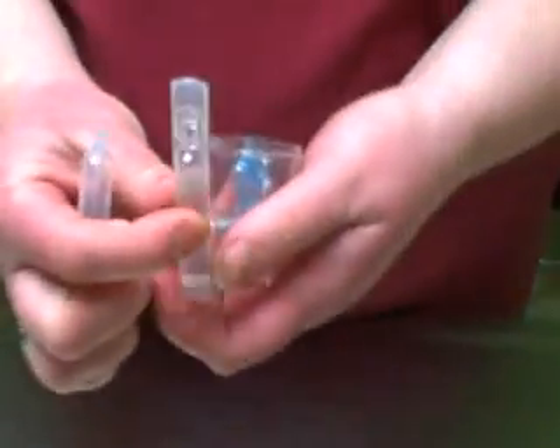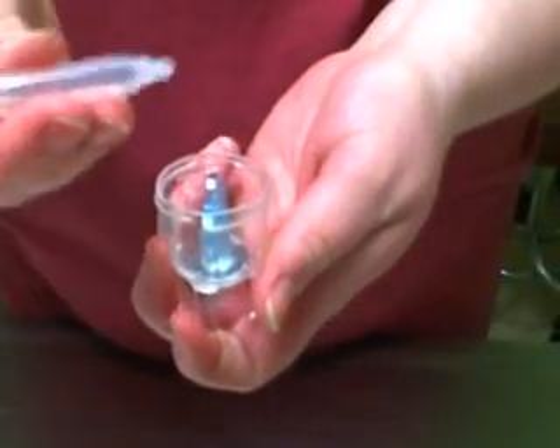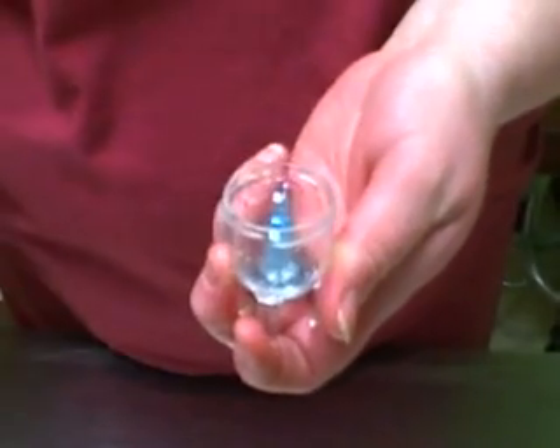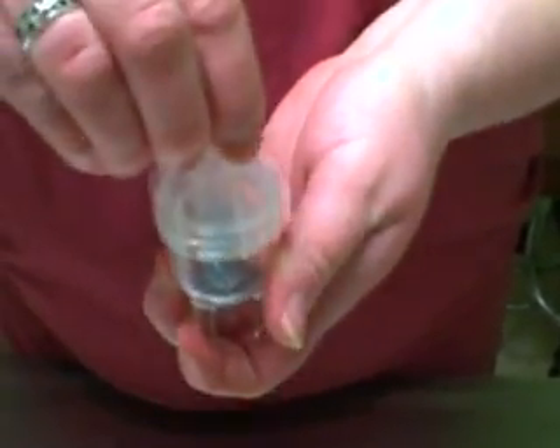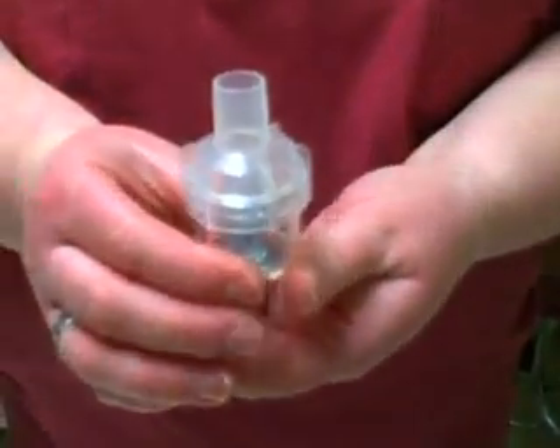Open up the medicine cup, open up the vial of albuterol, and then put the measured amount into the medicine cup. Put the lid back on and place the T-piece on top.